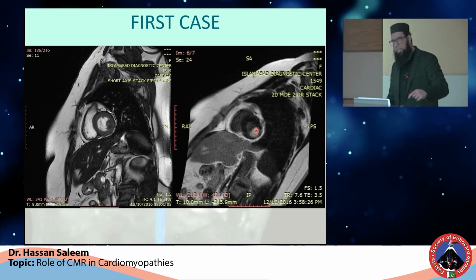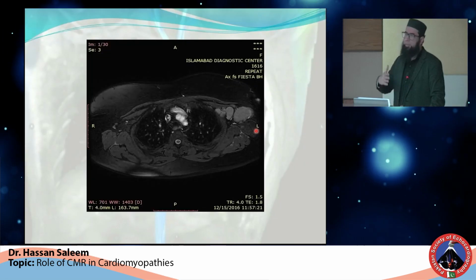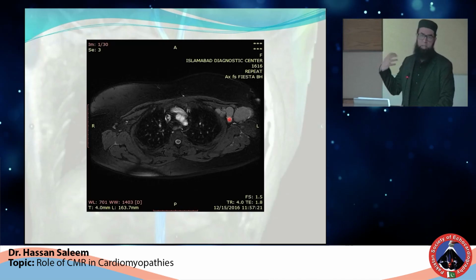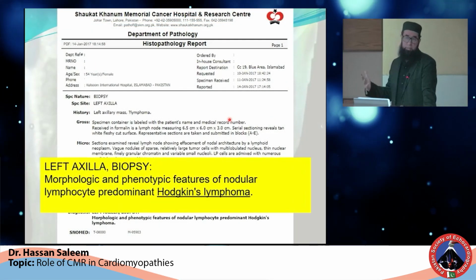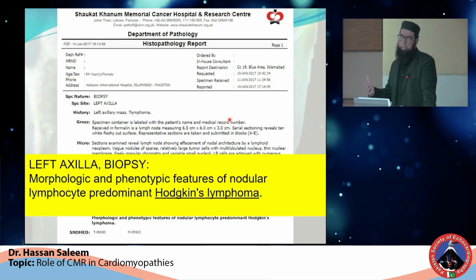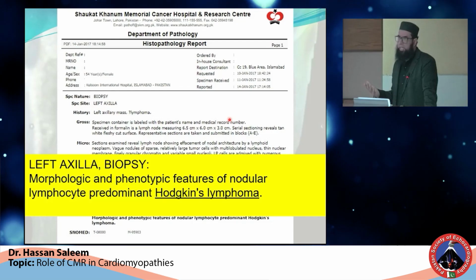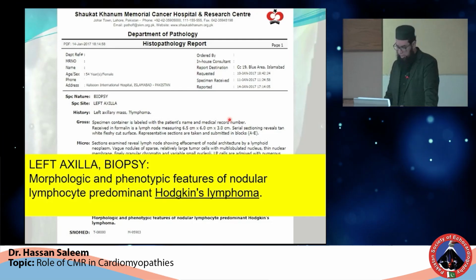Salman called me up and said, listen, I think it's kind of a secondary tumor. It doesn't look primary. You have to look at other images as well. So we found large nodal masses in the axilla. A biopsy was suggested and it turned out to be Hodgkin lymphoma. These are the patients who actually benefit from this imaging. And I'm still following this patient up. It's been, I don't know, 7, 8 years. That mass calcified after the chemotherapy, and she's still living.